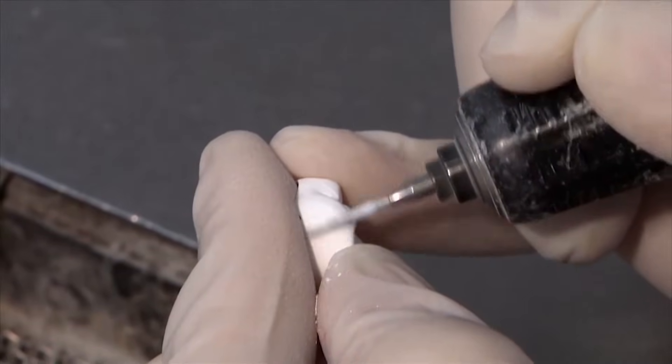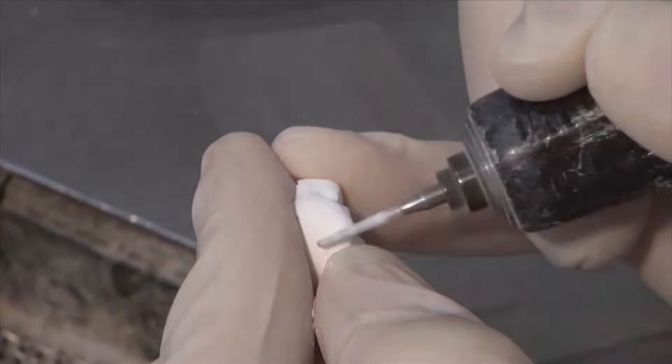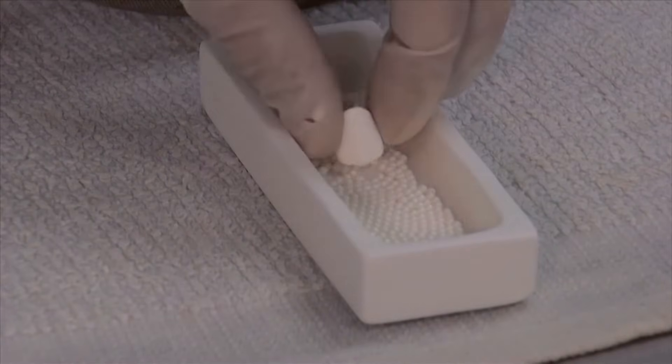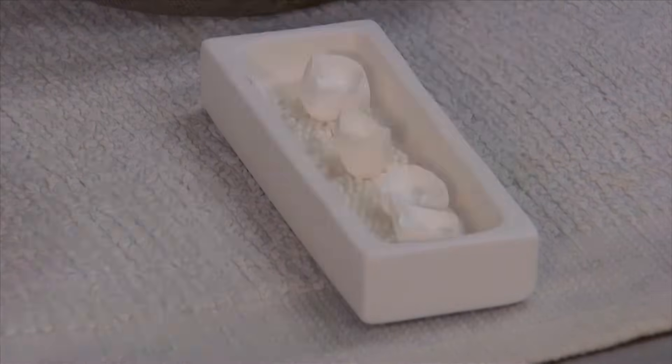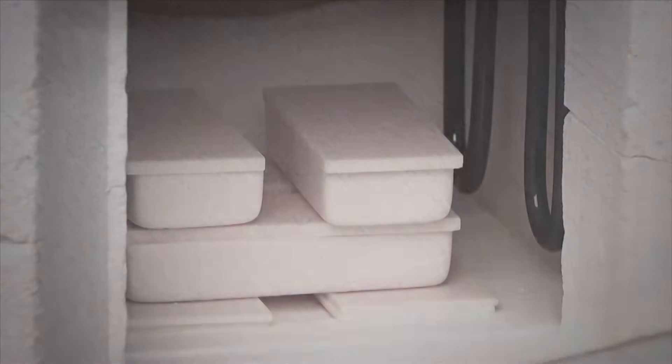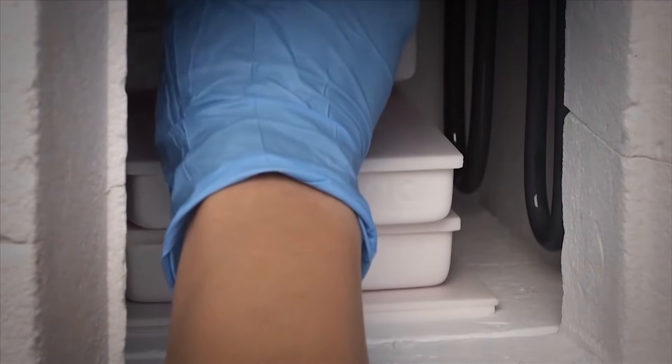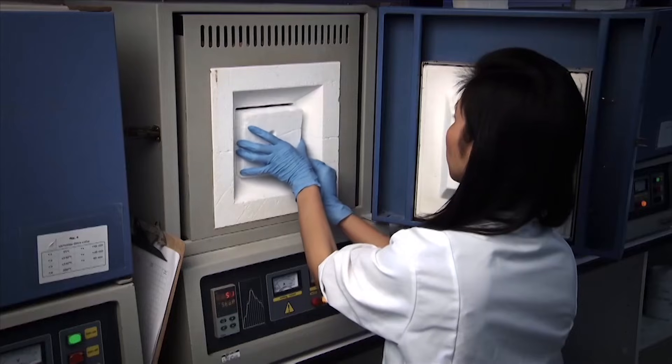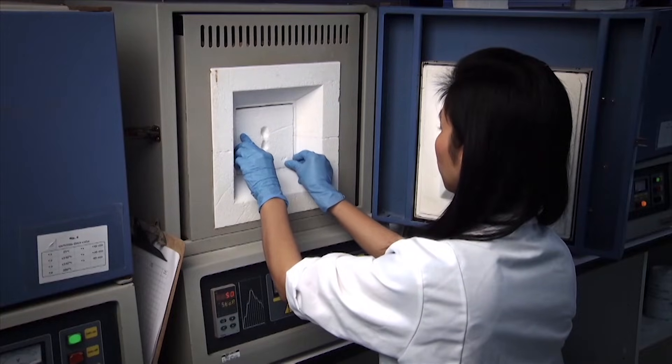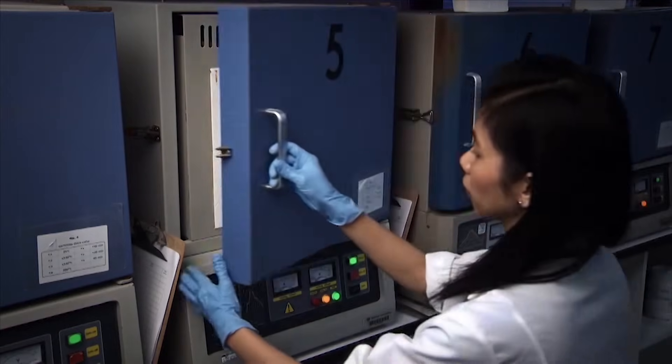So they're cut, sprues are removed, they're cut out of the disc, and they're put on those little aluminum oxide balls that you can see there because these are going to shrink roughly 21% while they're in the oven for nine hours. We need those little ball bearings to help so that when the crown actually shrinks, there's no contact between the tray and the crown or else it would distort the shape of it.